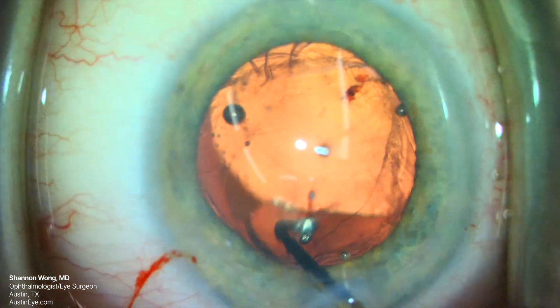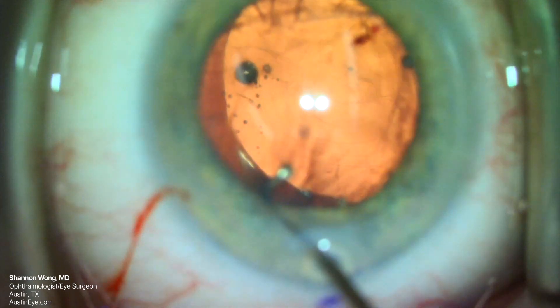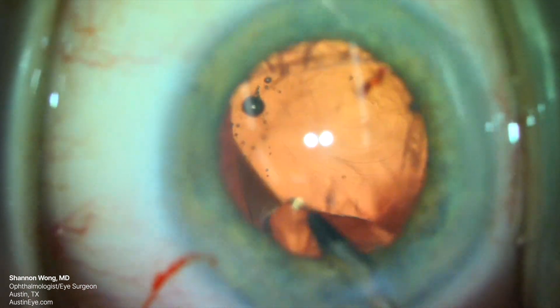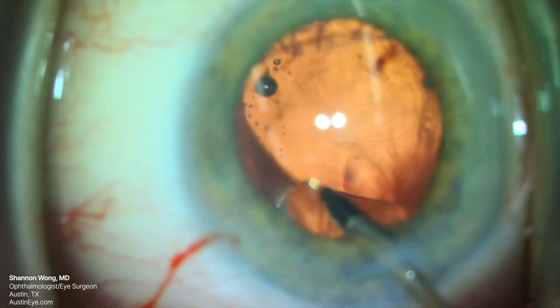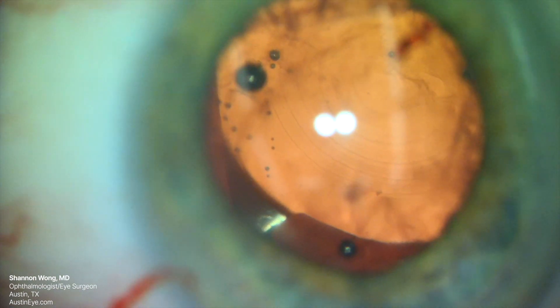We first try to lift the lens optic with a Conor wand, but as we bring the Conor wand toward the lens optic, the optic moves further into the vitreous. We then use micro forceps to try to grab and lift the haptic, but as we open our forceps, the lens again moves away from our instruments and wants to sink toward the retina.